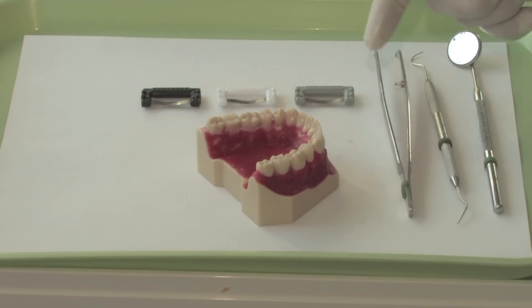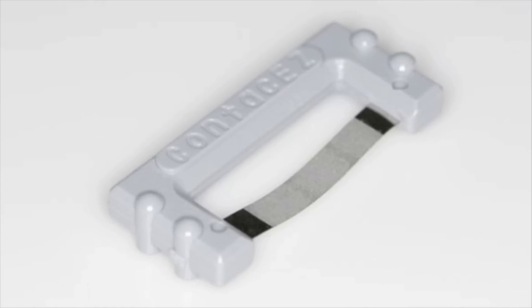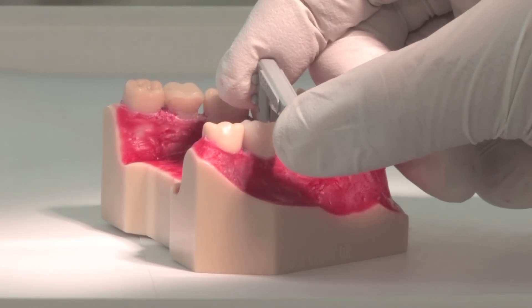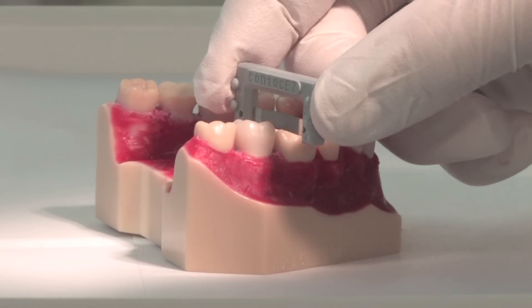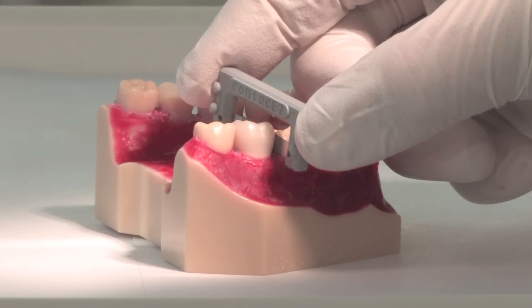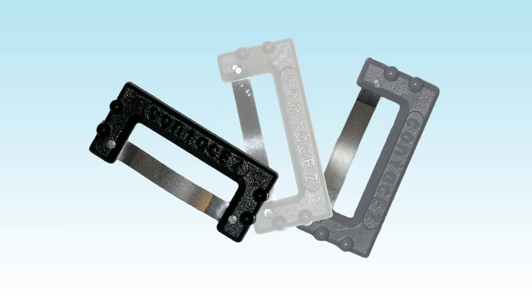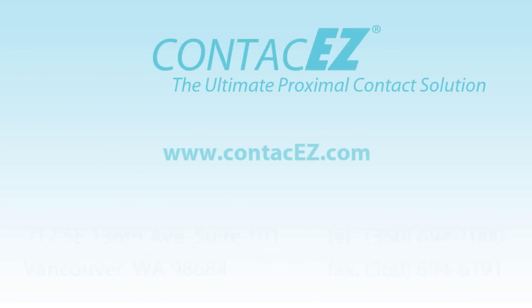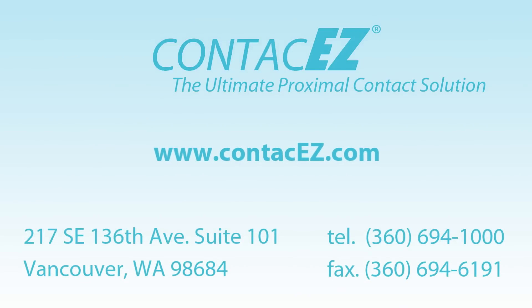The third and final step is to use the ContactEasy Final Polishing Strip. With ultra-fine abrasive diamond powder on one surface, it is ideal for the final polishing of proximal surfaces to restore a natural finish after definitive cementation. Patient-friendly, autoclavable, and reusable, the ContactEasy Restorative Strip System is the ultimate proximal contact solution.